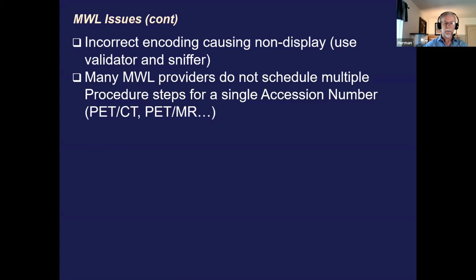And quite a few modality worklist providers do not schedule multiple procedure steps for the combo study. So then we have to do a workaround.